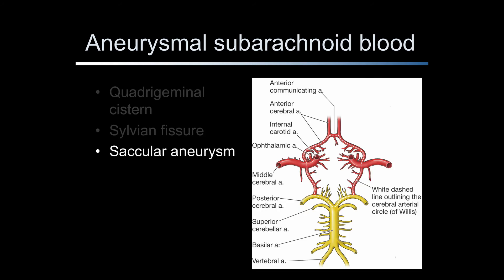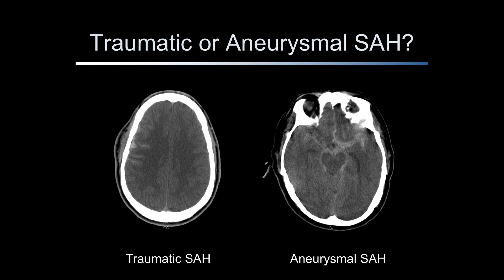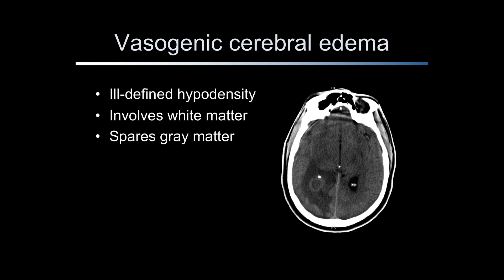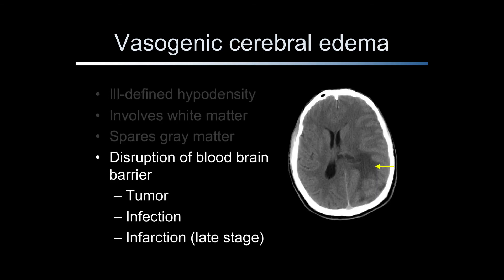It is important to distinguish between a traumatic and aneurysmal subarachnoid hemorrhage as the evaluation and management of the latter is much more extensive. Cerebral edema can be generalized or focal. There are two types of localized cerebral edema: cytotoxic and vasogenic. Cytotoxic edema occurs within minutes of the onset of ischemia and cellular functions are disrupted, resulting in cellular edema. Cytotoxic edema is difficult to see on CT scan. Vasogenic cerebral edema appears as an ill-defined hypodensity of the white matter and spares the gray matter. It is due to disruption of the blood-brain barrier and is seen surrounding tumors, infections, and in the late stages of cerebral infarction. Vasogenic edema in this patient is due to a large occipital tumor.